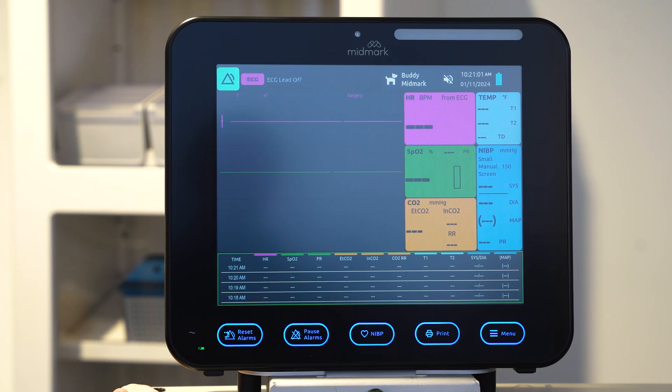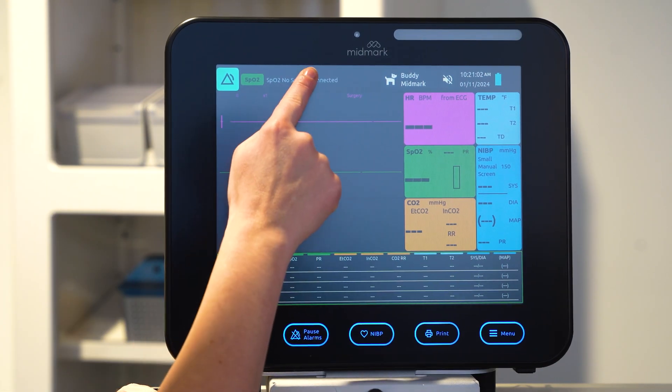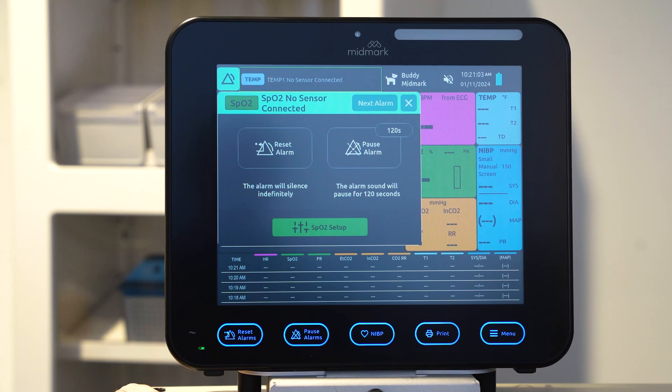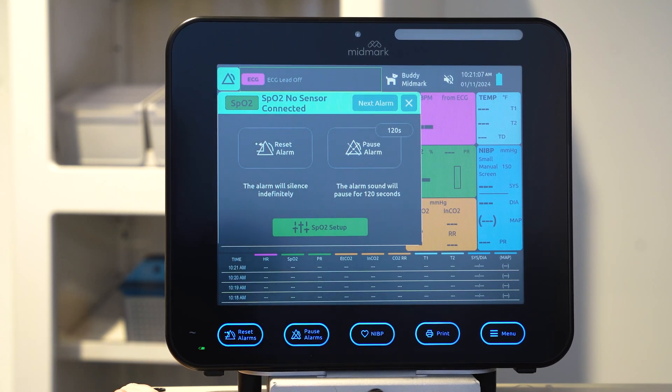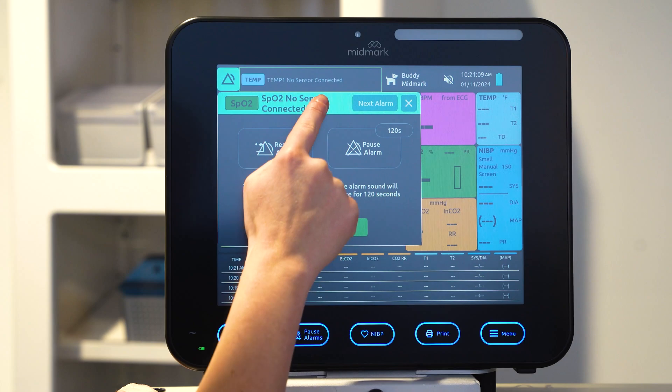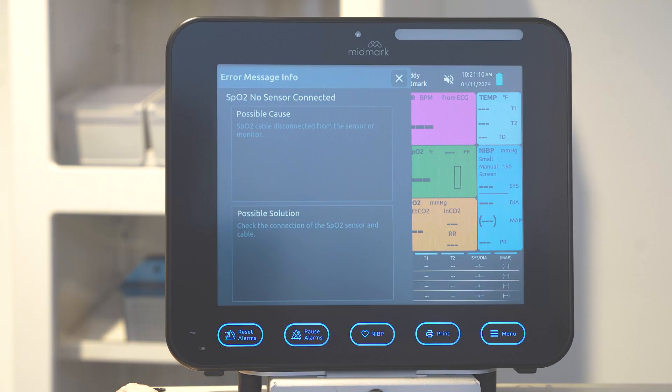To view the alarm center, select the alarm bar to reset or pause the alarm, or navigate to the parameter setup or technical alarm troubleshooting guide.